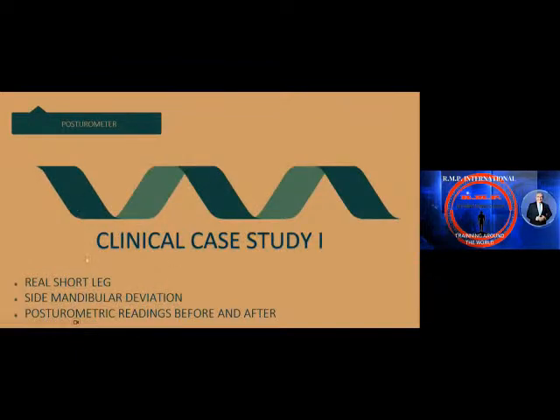This patient has a real short leg and a side mandibular deviation, and we observe the posturometer reading before and after the treatment. That's the proof that we have a real short leg measuring.